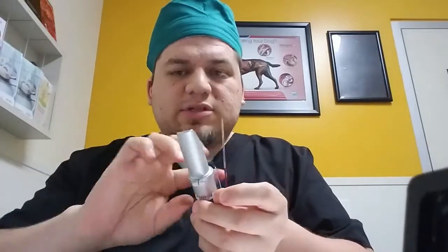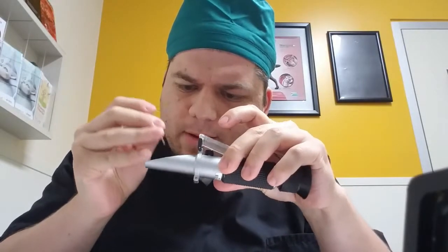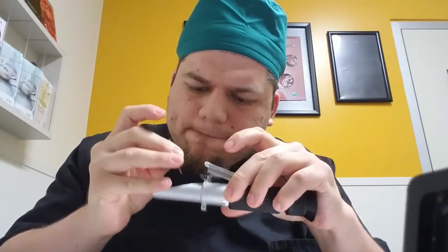Let me just clean this and make sure it doesn't have any values on it. So I'm going to break it right above the buffy coat. Now I'm going to try to get this liquid onto the refractometer. I got that in there. I'm looking at it and I'm getting a total protein of 7.4.